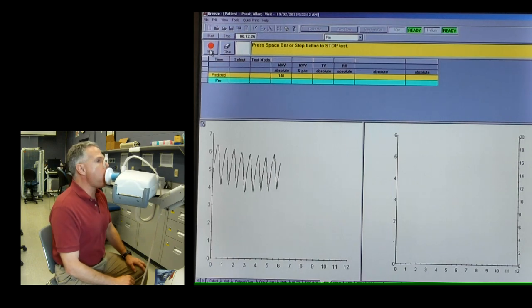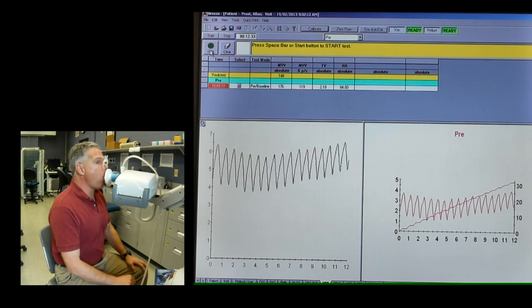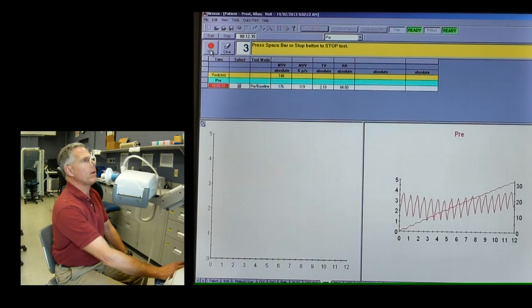Breathe hard and fast. Keep going, up and down, up and down. Keep on, keep going. Don't stop now. Keep going. And that's enough. You can release. Okay, that's the end of test.